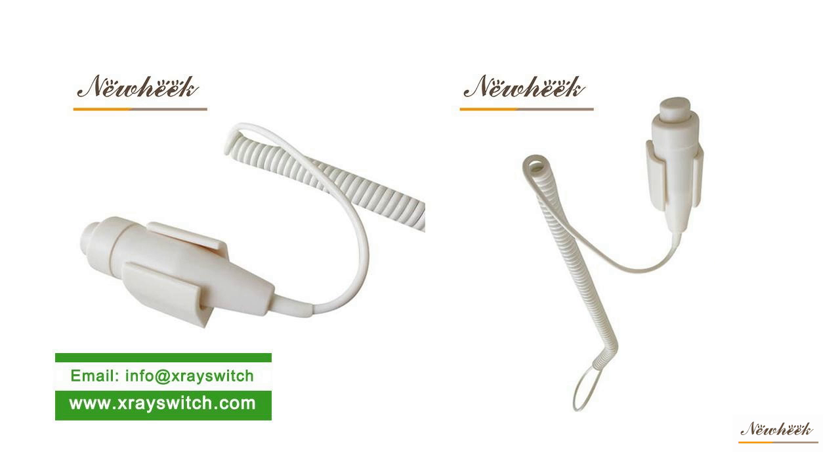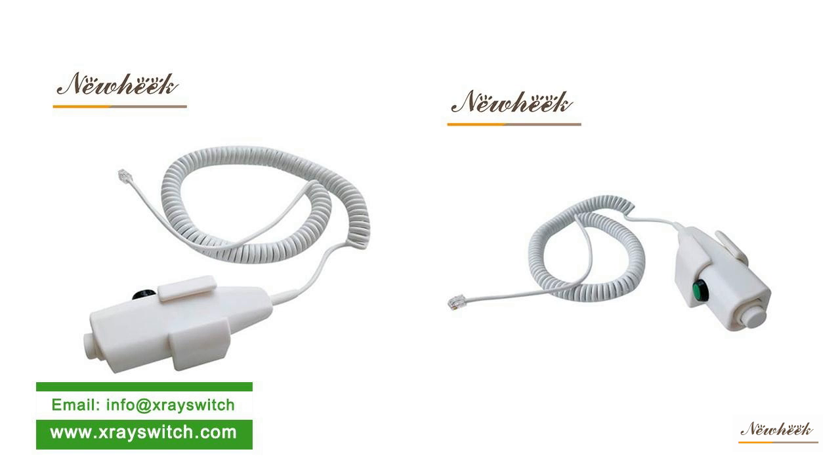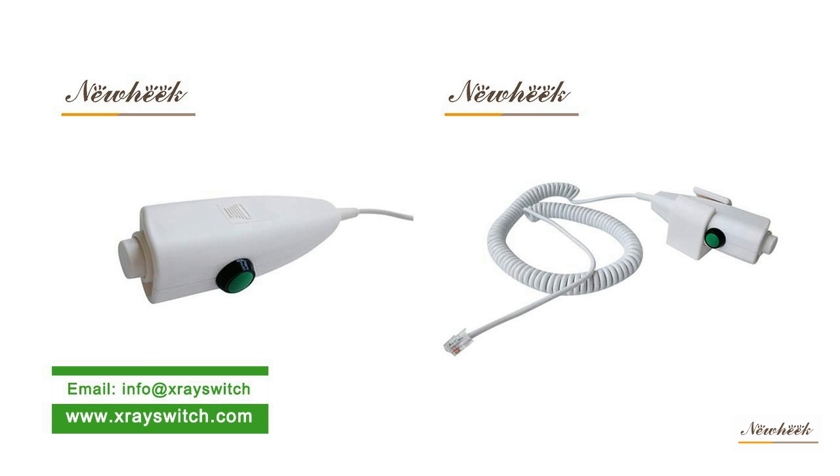The spring wire of our X-ray hand switch can be equipped with three meters three cores, three meters four cores, six meters three cores, six meters four cores, six meters six cores, and ten meters three cores. The length of the spring wire can be customized according to the customer's demand. New Heek X-ray hand switch can meet your different purchasing needs.